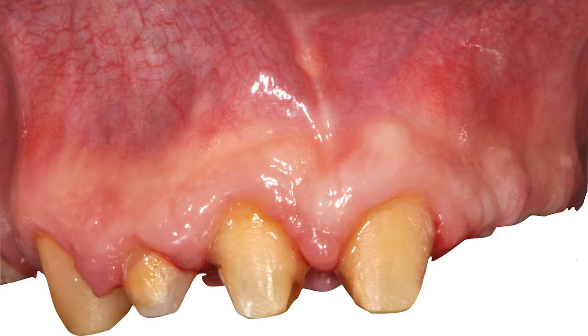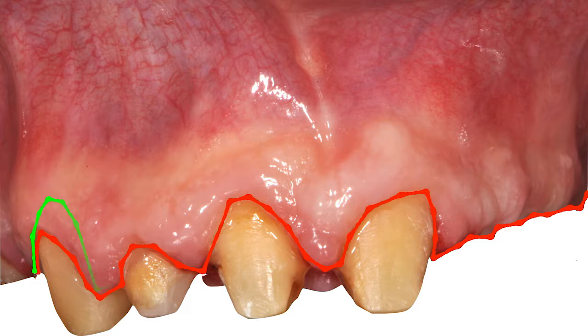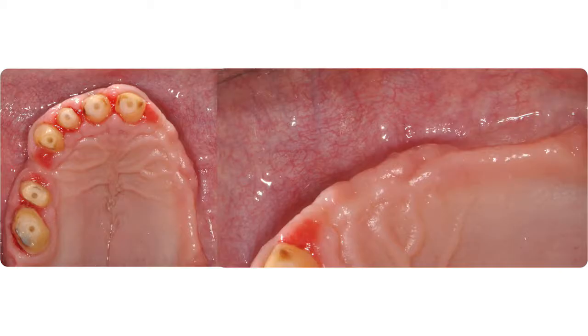Now, we had to think about the final aesthetic results. If I have natural dentition on the right-hand side, and then implants on the left-hand side, I have to think already about the free gingival margin and the final aesthetic appearance of this patient. So we did periosurgery, and of course aesthetic crown lengthening, but also the treatment with osteoresective surgery of periodontal disease. Now we have to face the second quadrant, where we have this knife-edge ridge.